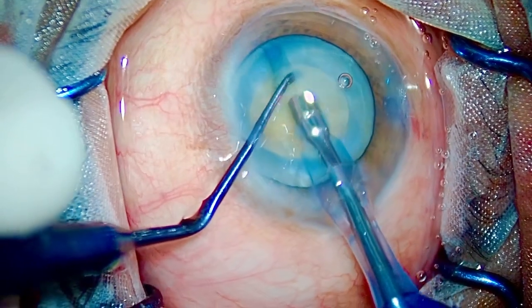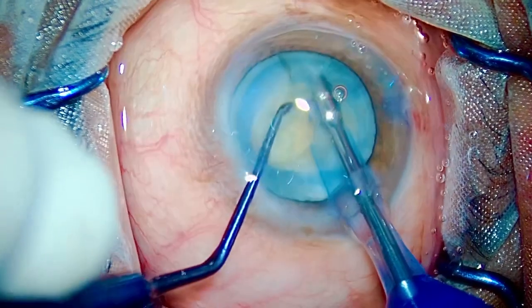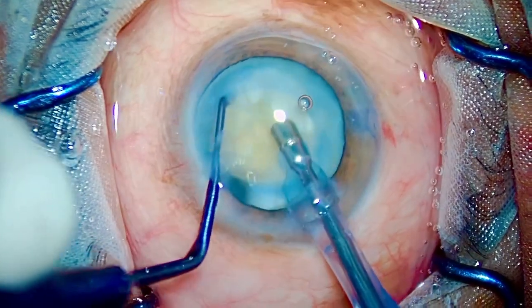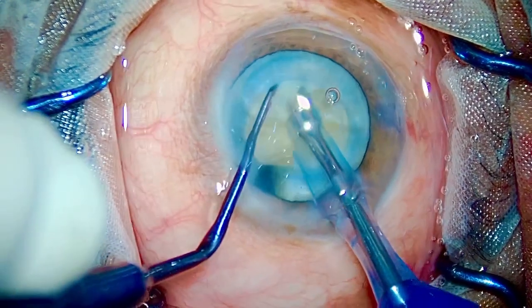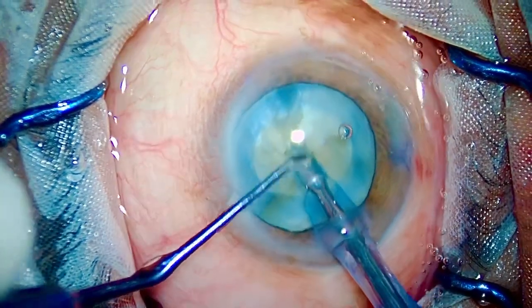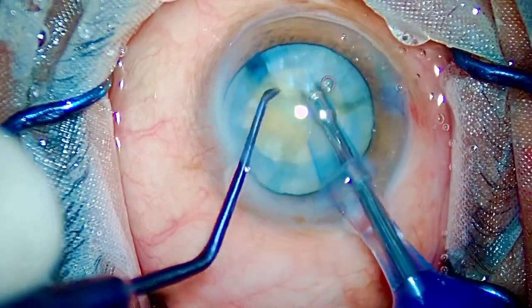Separating the pieces, dialing the nucleus — FACO position three, FACO position two and chop. Just repeat the drill: FACO position three, going in, FACO position two, holding the nucleus and chop, then separate the pieces. Holding the endo-nucleus, trying to separate it — FACO position three, two, split, chop.